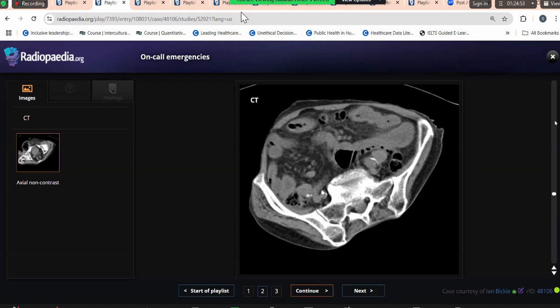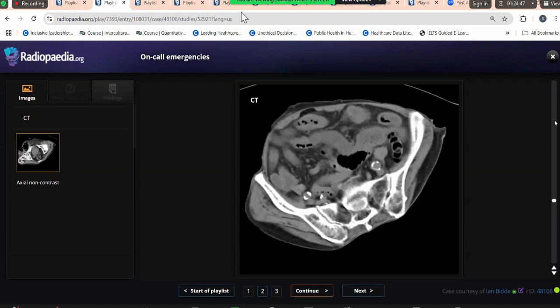If the patient is immunocompromised and diabetic, then this patient requires urgent management regarding the necrotizing fasciitis. I would alert the referring physician regarding this finding.